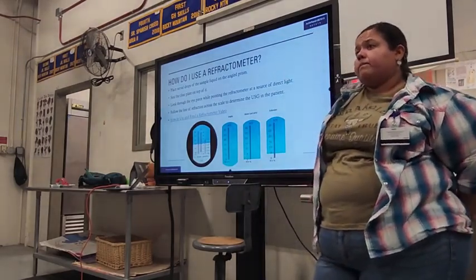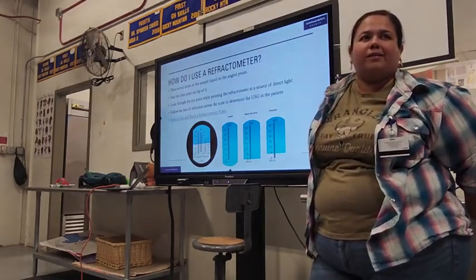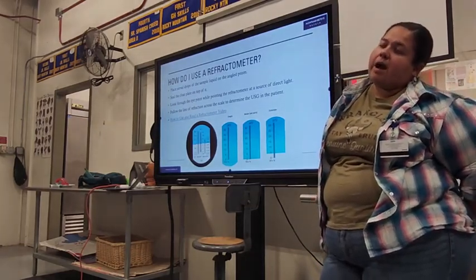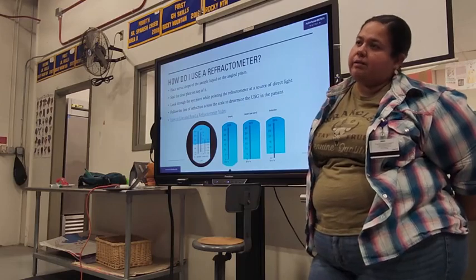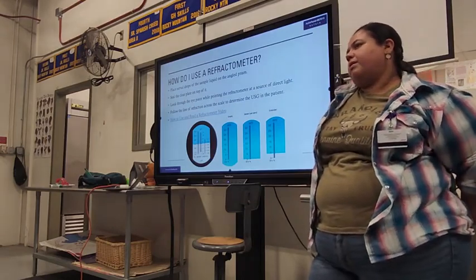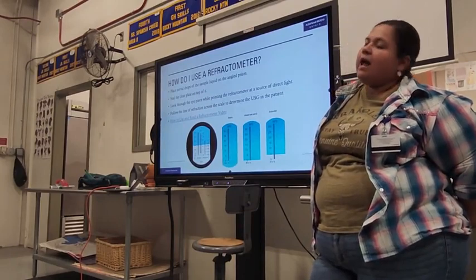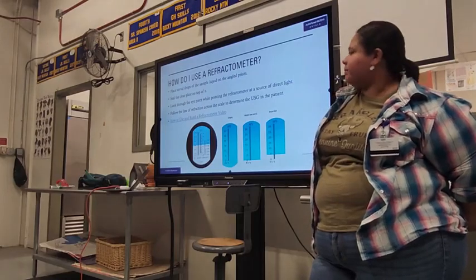Yeah, and we'll practice with the refractometer, which is why we need urine. Okay? That way you can see in real time how it works, to give you some practice on how to read it. Okay? Is the concept understandable though? Yeah. You sure? I think you have to see it done in order to explain it. Okay. And there's no way for me to do that right now.